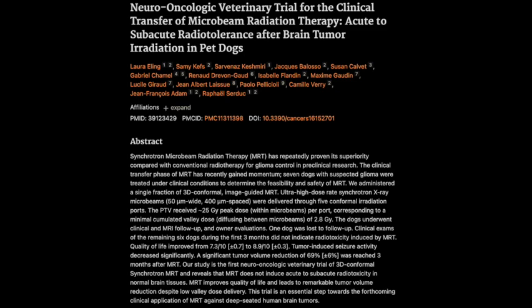Okay. The speed at which they delivered the radiation. The study mentions flash dose rates, thousands of grays per second. Wow. That's significantly faster than conventional radiation therapy. Flash, it does sound incredibly fast. Yeah. What's the advantage of delivering the radiation so quickly? Well, early research indicates that flash radiotherapy might spare normal tissue from radiation damage while effectively killing tumor cells.